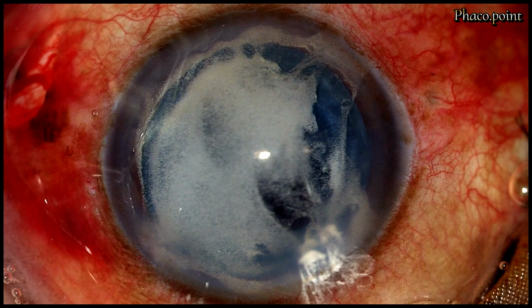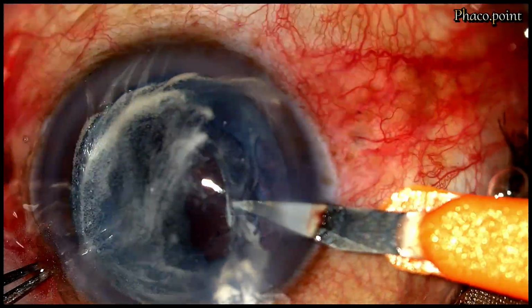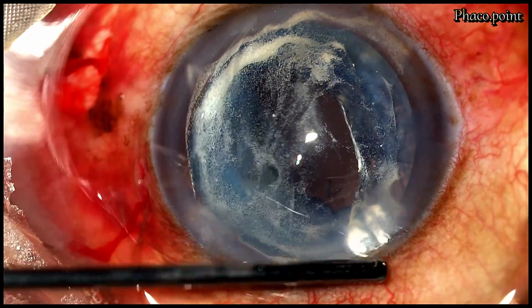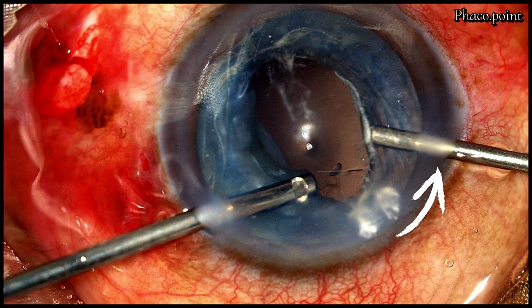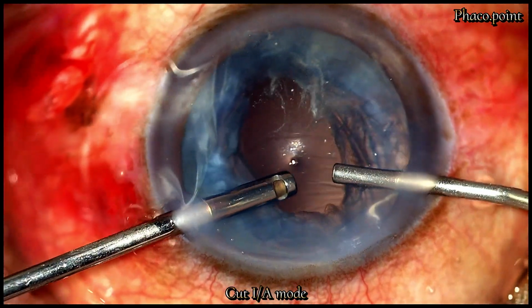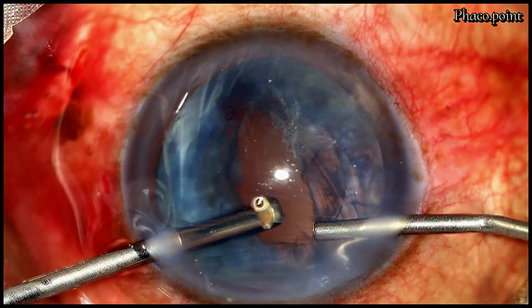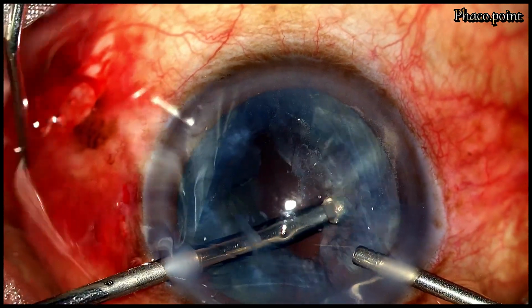The paracentesis incisions are suitably enlarged to allow for the entry of a 20-gauge cutter, after which we start with the anterior vitrectomy. At the outset, the vitreous that's prolapsed out of the incisions is cut, after which I introduce the irrigation to the right side port incision, whilst the 20-gauge cutter is introduced into the anterior chamber and starts to cut the vitreous. The vitreous is first cut from just within the incisions and then from the anterior chamber. Having cleared this, we then move to cut the vitreous in the area of the pupillary plane and finally in the area of the PCR.